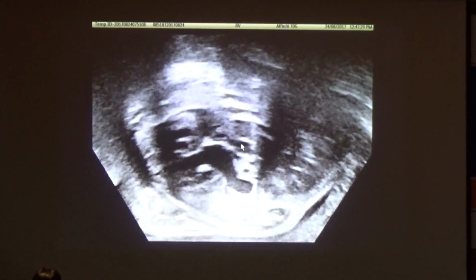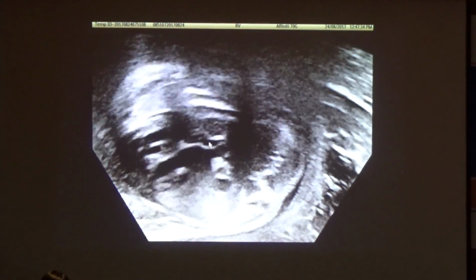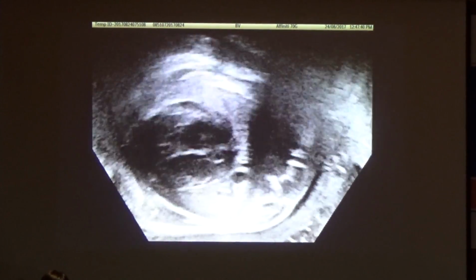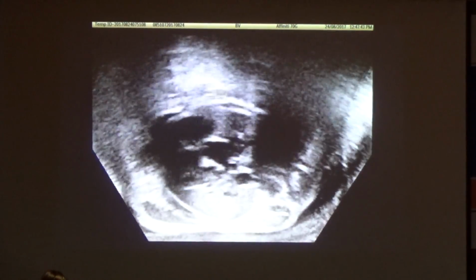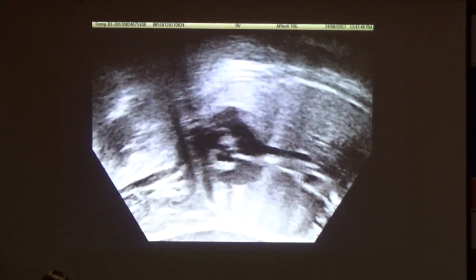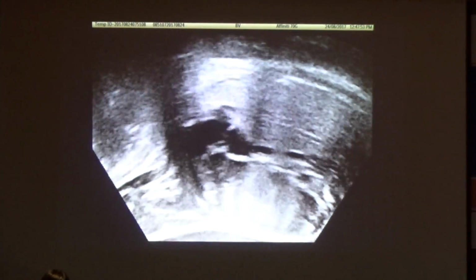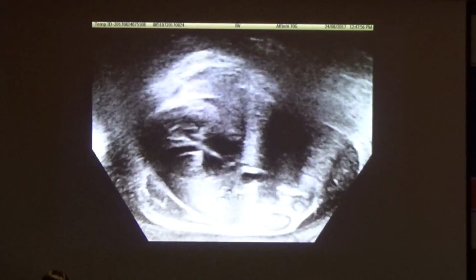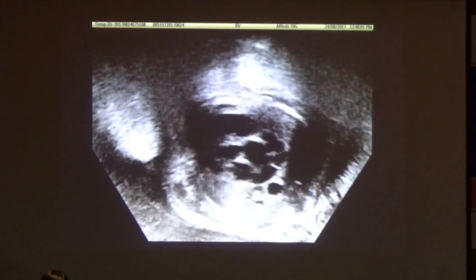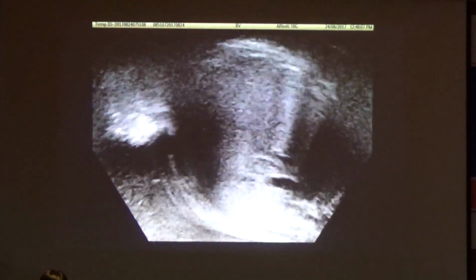There's the aortic valve. I can see it right there. Mình không thấy được cái cung động mạch chủ. There's the aorta. Do you see the aorta? Không thấy được cái cung động mạch chủ. Đó là vấn đề nó khó khăn. Very disparate size there. I'm going to come a little bit. Đôi khi nó bị hẹp eo động mạch chủ nặng hoặc là nó đứt đoạn luôn cái động mạch chủ. Bởi vì ngay đầu tiên mình thấy hai cái động mạch đó. But the aortic valve is a nice size structure. That must be some artifact about the way I'm doing this study. There's the aorta, but no, I don't see the arch. No, that could be just that I'm a lousy echocardiographer.